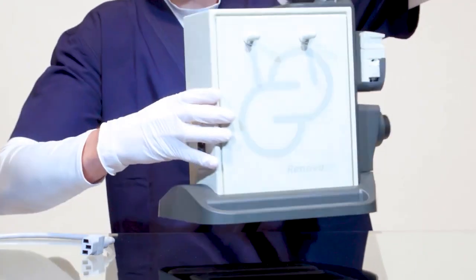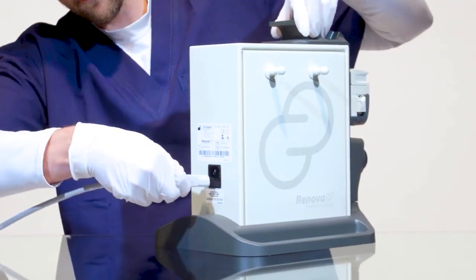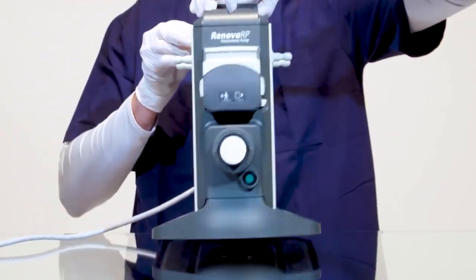Operation of the pump begins with ensuring the power cord is plugged into the back of the pump and then into a standard electrical outlet.